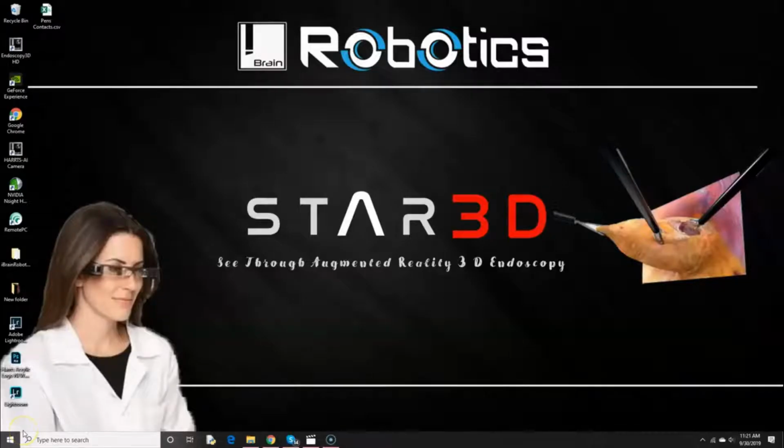Welcome to iBrain Robotics. This is the demonstration of our STAR 3D See-Through Augmented Reality 3D Endoscopy.